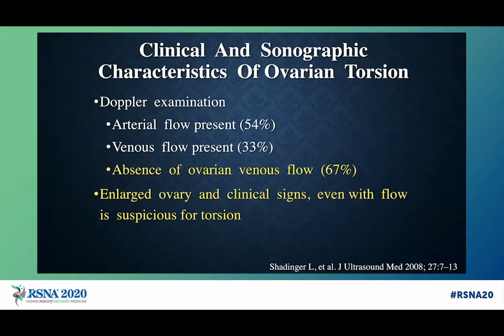which leads us to the conclusion that if you see an enlarged ovary, particularly in an unusual location, with signs concerning for torsion, even with internal blood flow, you should be suspicious for ovarian torsion.